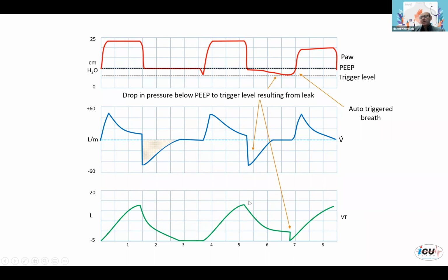So let's just say your tidal volume is calculated based on the predicted body weight as 400 ml, for example, and you put that 400 in, and you have 100 leaked. It's going to be very difficult because it's not like you put the 400 in and 100 directly goes into the leak area. It may actually go into the lungs and then disseminate and leak out.